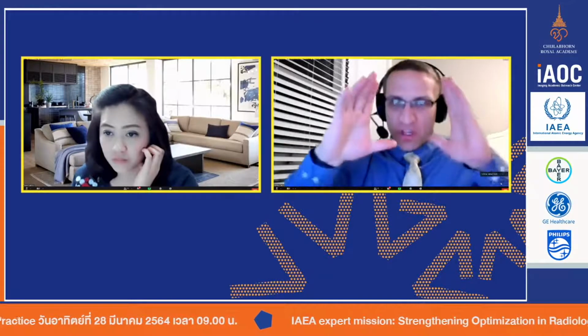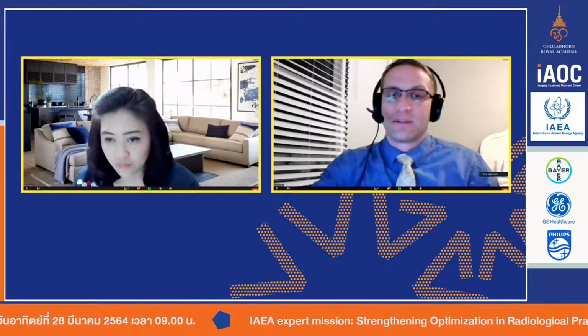So for what you are doing right now with the diagnostic reference levels in Thailand, you're collecting most of your information for single energy or traditional CT. But for institutions in Thailand that do use dual energy, it would be very important to collect that data, because there will come a point, maybe in the next 5 years or so, where you will see more and more use of dual energy.